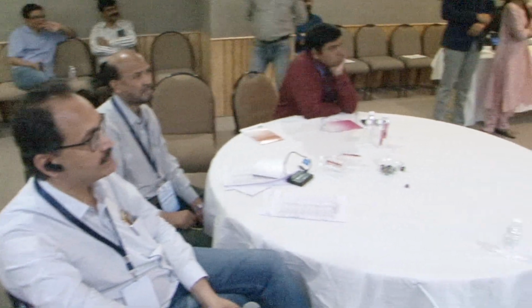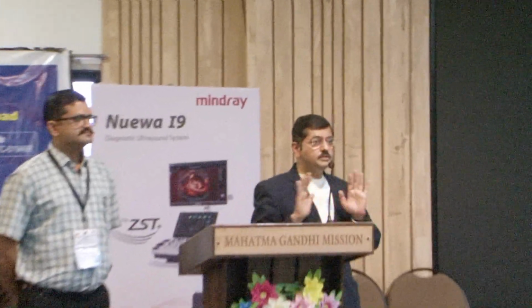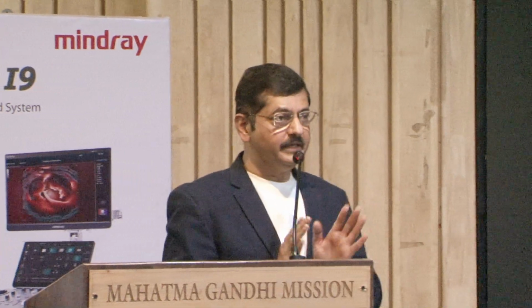No. See, laterally targeted, because all the CA prostate will start from the peripheral zone. It's very clear. There will be no prostatic cancer which will start from the transitional zone or the central zone. If you are targeting the lateral part of the prostate, automatically you are in the peripheral zone and your yield of cancer detection is going to increase. Now, if you see a small hypoechoic lesion in the transitional zone, the chance of that hypoechoic lesion being malignancy is only 20 to 25%.